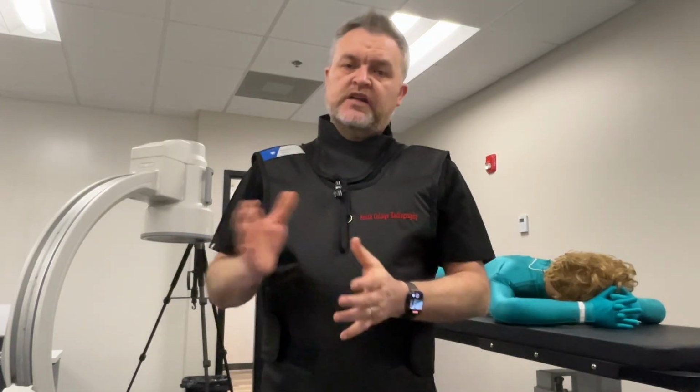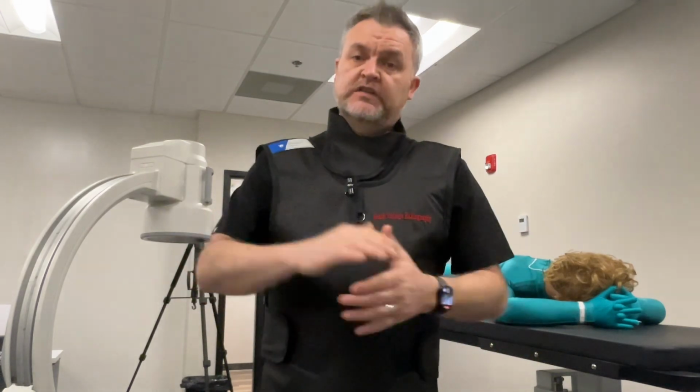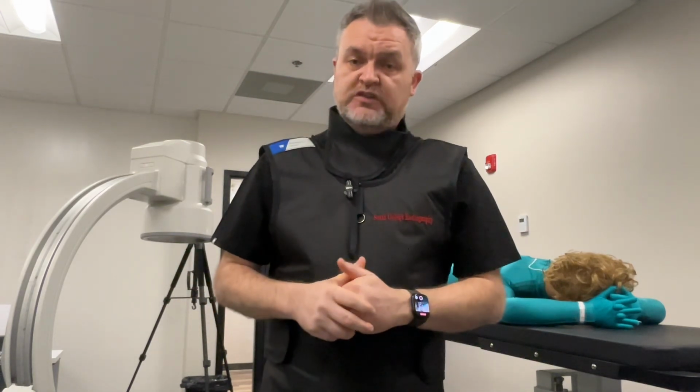Obviously, let's talk about the lumbar spine. Surgeon says come on in for an AP. So let's walk through the entire process from approach to getting that perfectly displayed image on the screen.